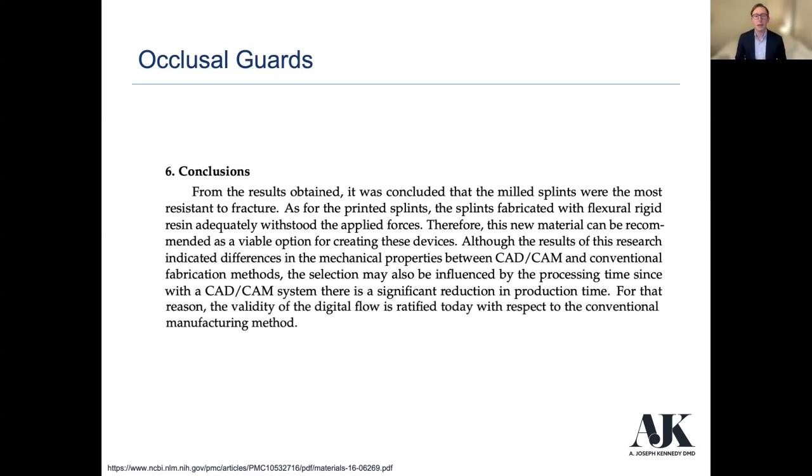What I'll say with that, having used both types, is that we've had patients who will break a milled PMMA splint. For that patient, I wouldn't say, oh, well, let's make you a new one and use resin for that. I would be really reluctant to do that, as we know it's maybe not going to hold up this much. So be mindful. This is all patient specific to the case and the use. But if you're looking for the strongest material, milled PMMA is going to be there. But we know that resin-based splints are certainly appropriate for many patients and can withstand those applied forces just fine.